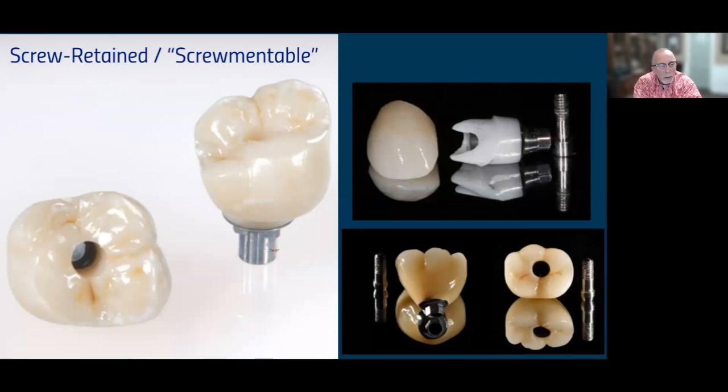And they typically call hybrid abutments, where we buy or use a stock part and make a custom abutment top and then make a custom crown on top of that. And I'm always worried about those a little bit, right? Because I've got two different cementing things going on, just more things that could come loose or break.